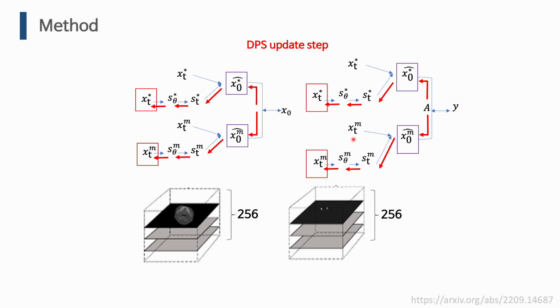However, diffusion posterior sampling requires backpropagation through the diffusion model at every gradient step during the cone-beam projection guidance process, which requires too much memory usage. If there are 256 CBCT slices, 512 computational graphs for the two diffusion models must be simultaneously loaded into the memory.